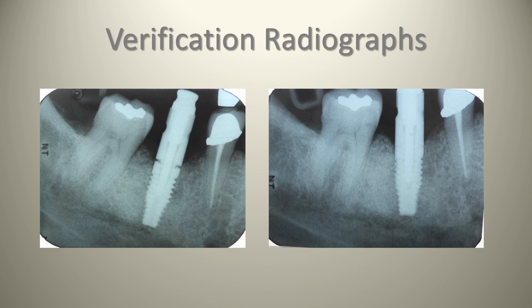So it's important to make sure you take these verification radiographs to ensure that these impression copings are seated, because remember, you're trying to take an accurate picture of the clinical scenario and replicate that in a model that you send to your lab.